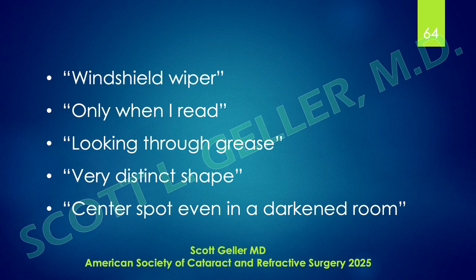If they say it's like looking through grease, it's usually a big fibrillar mass in the mid-vitreous. And when they say it's very distinct, I see this line with little bubbles in it, I'll say to them, you mean, is it about the horizontal midline? Yeah. They understand what I mean by that. And I say, is it usually maybe 20 degrees lateral towards the outside?